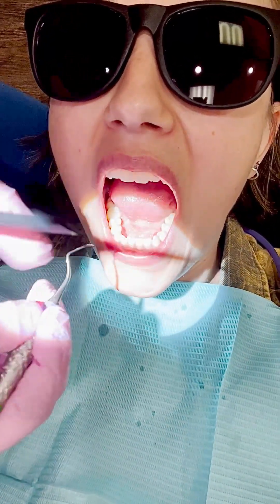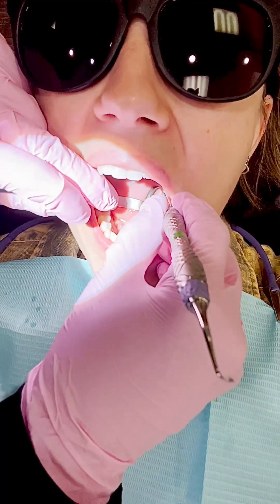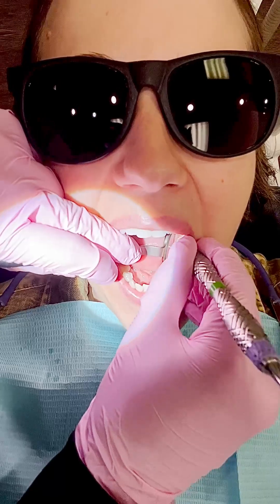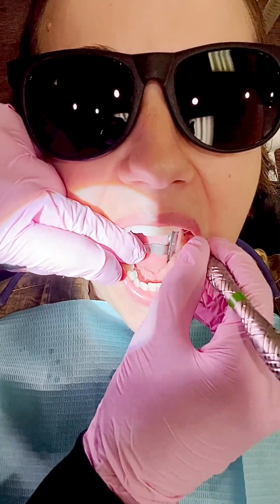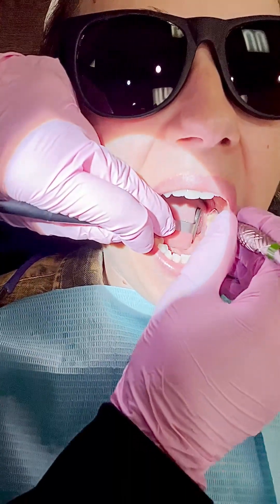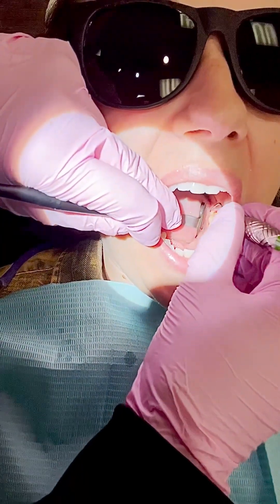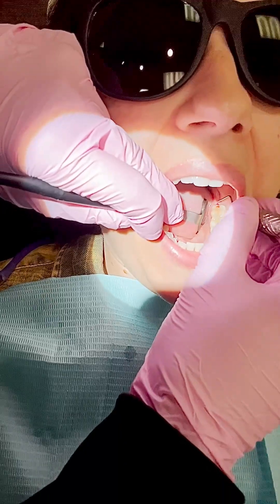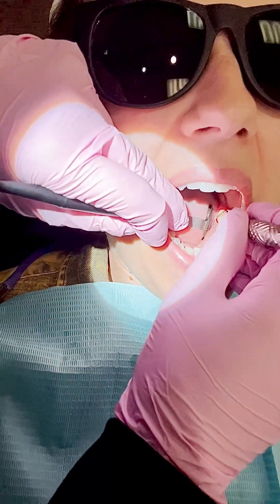Now I'm going in with a universal curette — not a sickle. There's a green sticker on it. This is an extended curette. I love this on the linguals of the lower anterior teeth. This is so good, especially where there's all that plaque — I call it 'placulus' — right around the linguals. I'm getting on that distal angle really good, back and forth. I scrape around and scrape down. I go over my strokes a lot — it's really important.